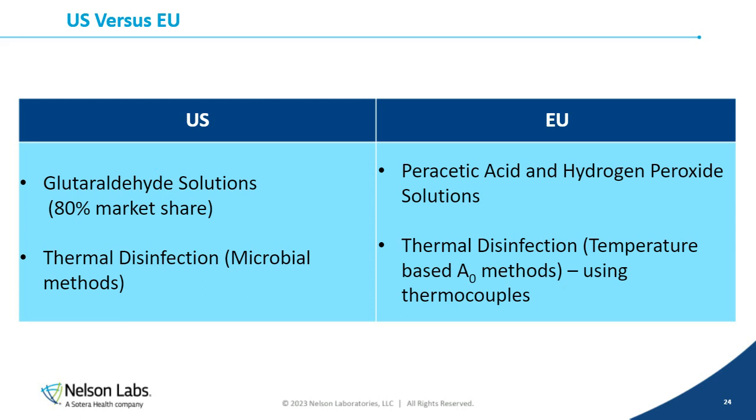However, in the EU, they prefer more A0 methods. So this is a temperature-based method, very similar to the F0 method for sterilization. It's a time versus temperature kill rate using a specific Z value. It uses thermocouples, so it does not use microorganisms. It uses thermocouples that you'll attach to your device and monitor the temperature over the thermal disinfection phase. So again, if you're marketing in different regions, you may want to take into account where you're marketing and how that thermal disinfection is being performed.